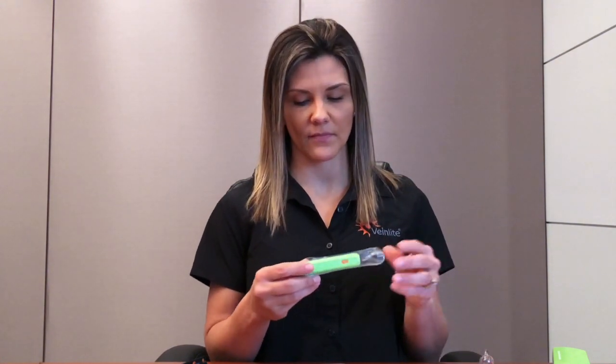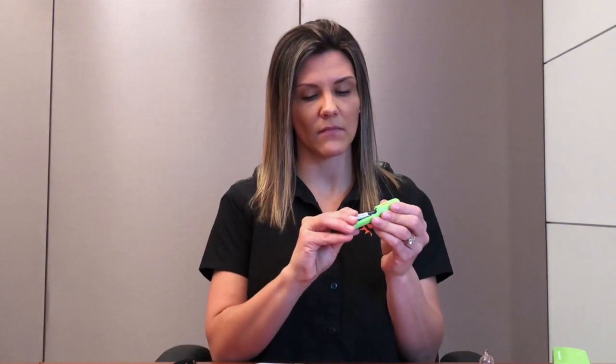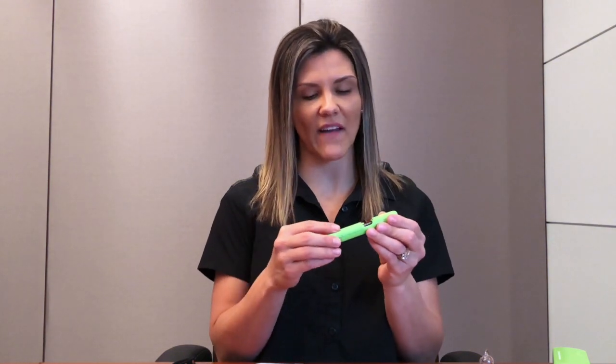To install the AAA battery, simply slide the battery cover off, install the provided AAA battery, and then replace the battery cover back onto the device.